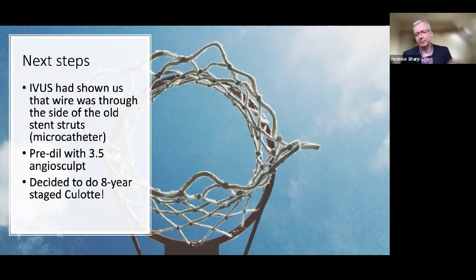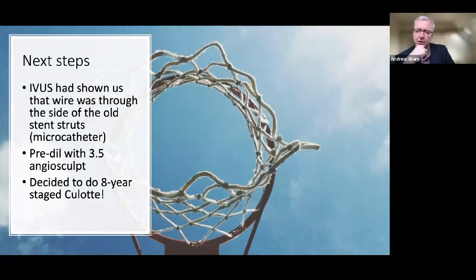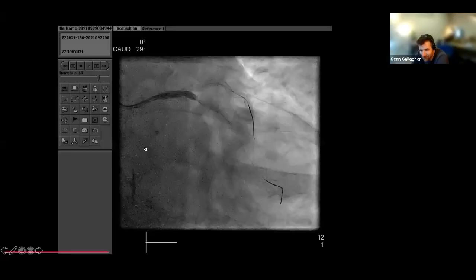Yeah, I think if we'd have wired behind the left main portion of the stent into the circ, and then maybe we were pushing hard with our IVUS to get through, we may have deformed that segment. We may have chosen to crush it across, and then do a crush technique with the stent from the left main into circ, and then recross and kiss into LAD. But because we've fortuitously wired through probably the third cell of the left main stent, we're set up beautifully. We've done one half of a culotte. The only thing is we did it 8 years ago. So we then move on.